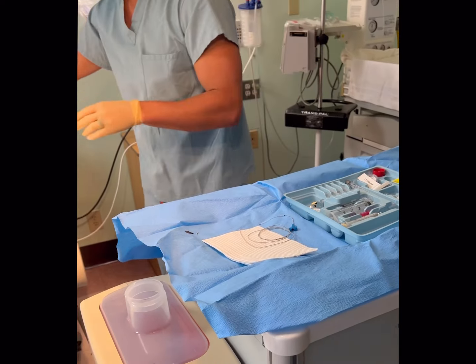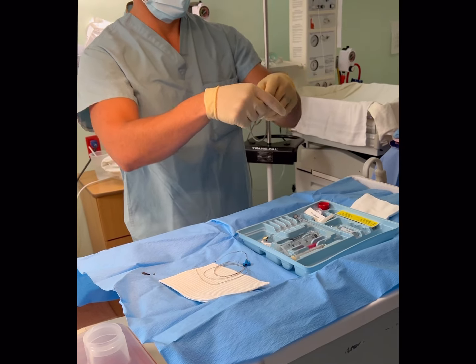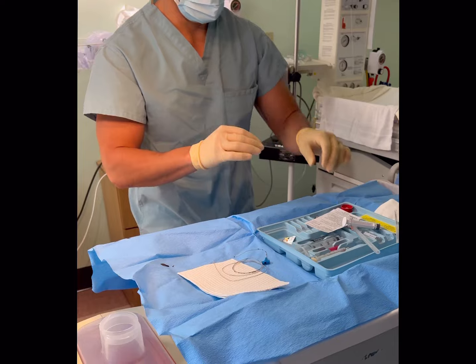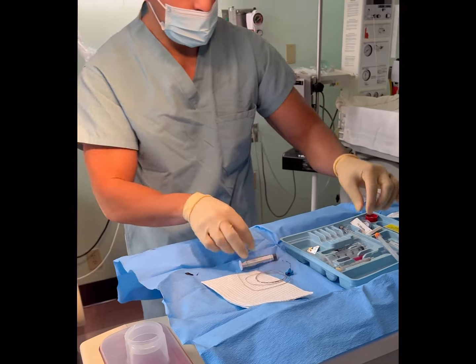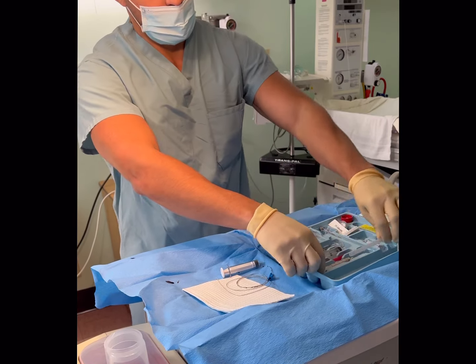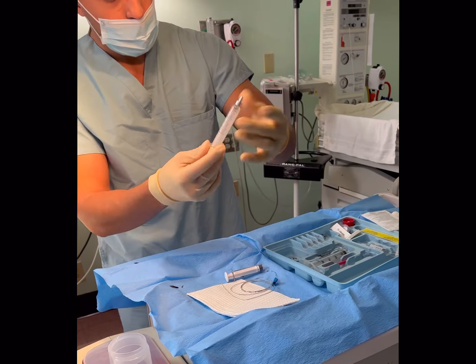That's going to be my plastic loss of resistance syringe. Because this kit, for some odd reason, comes with a glass one. So this is my plastic loss of resistance syringe, which I love. This is a glass loss of resistance syringe — they're okay, they're just not my favorite.